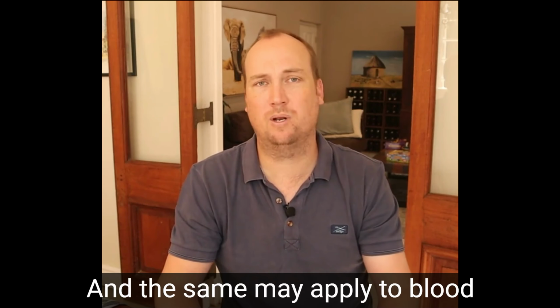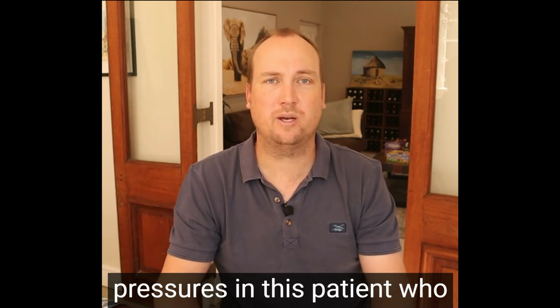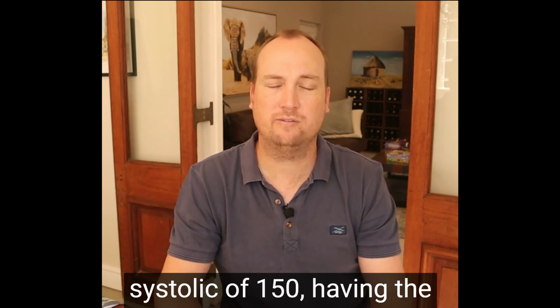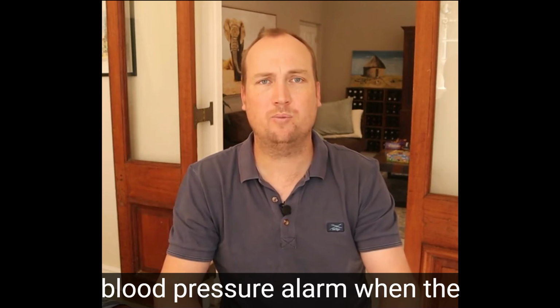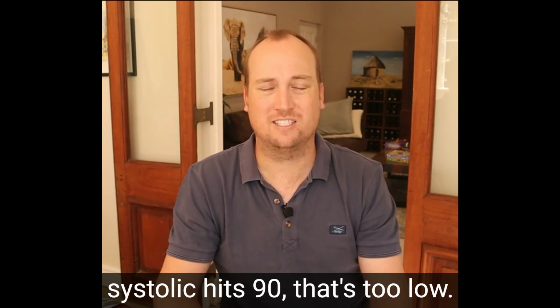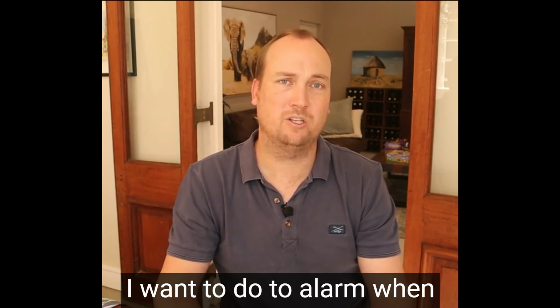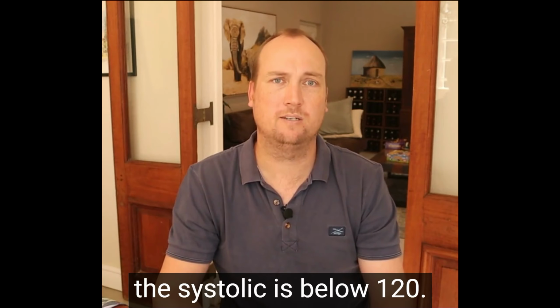And the same may apply to blood pressures. In this patient who has a baseline systolic blood pressure of 150, having the blood pressure alarm when the systolic hits 90, that's too low. I want it to alarm when the systolic is below 120.